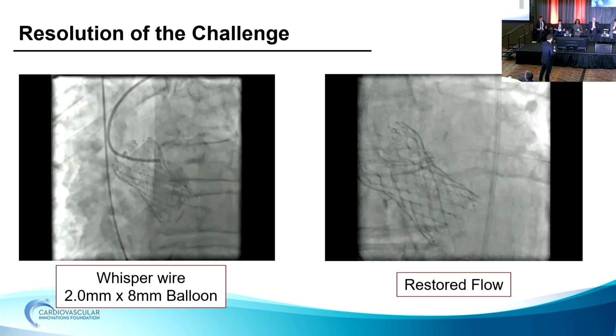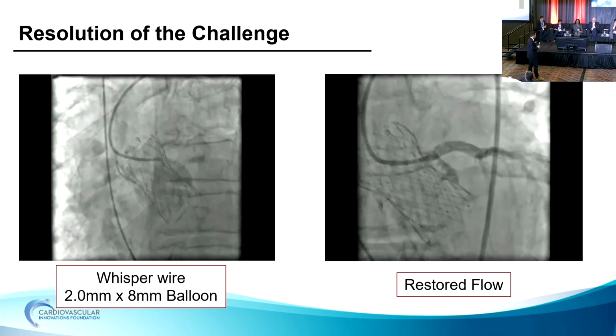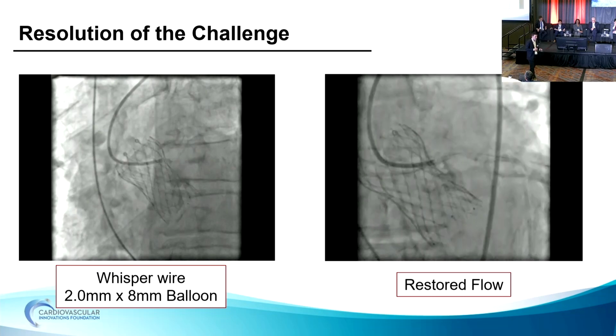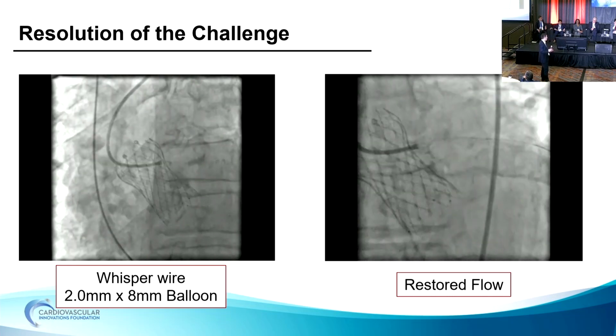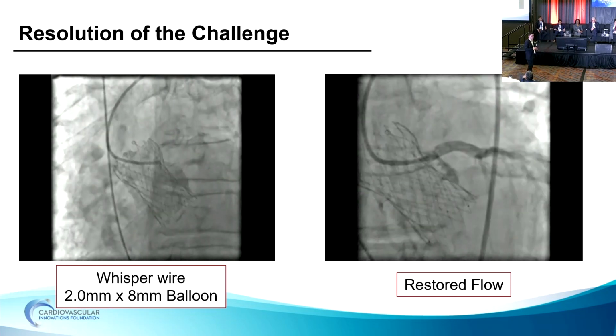There are different catheters. I know there are people out there that talked about JL 3.5 guides. There are people who do XB 3.5. And there is data actually, in some of the trials, the majority of the patients are actually being done with JLs. Having said that, it's not 100%. So if you're feeling comfortable with another guide, you can try it.